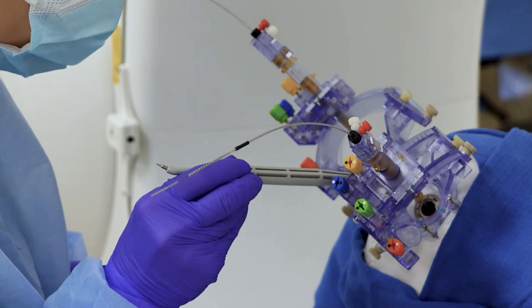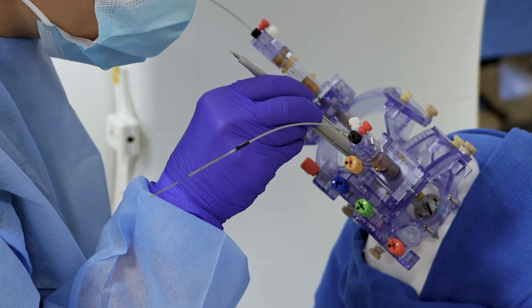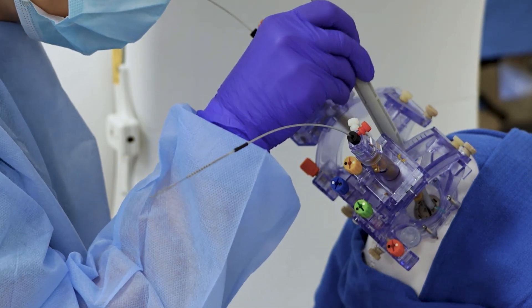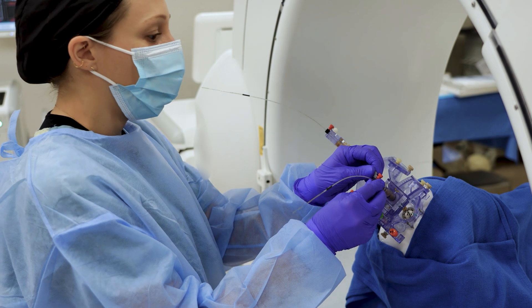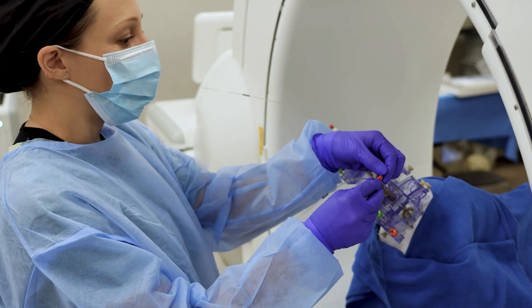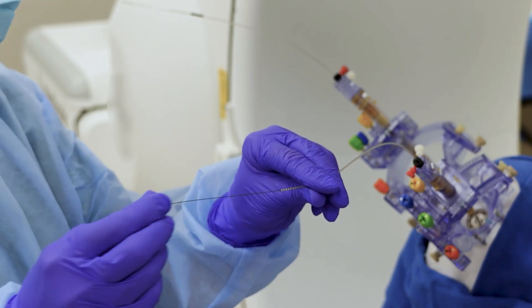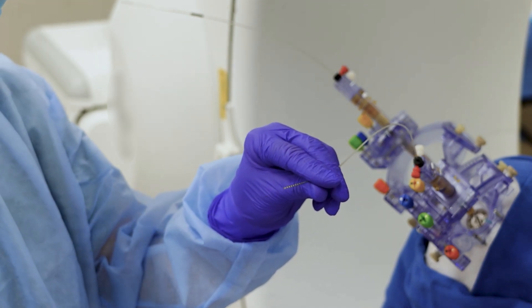The DBS leads are then secured with the manufacturer's anchoring clip. The DBS lead stiffening stylet is removed and the lead is pulled down through the SmartFrame so the tower can be disassembled. Closing is completed per standard procedure.